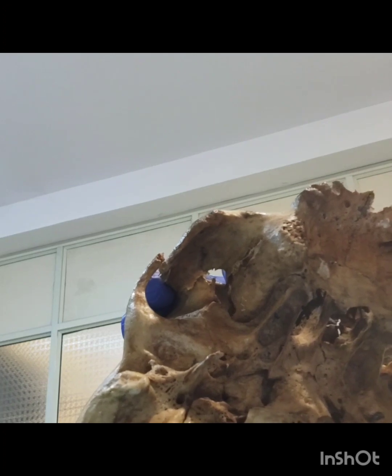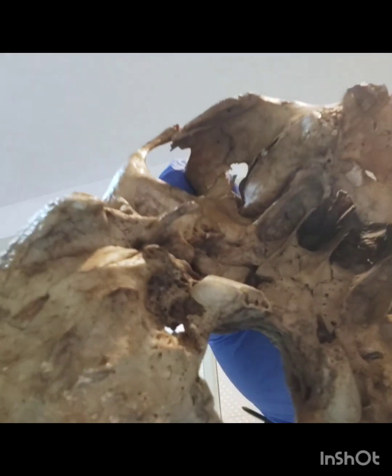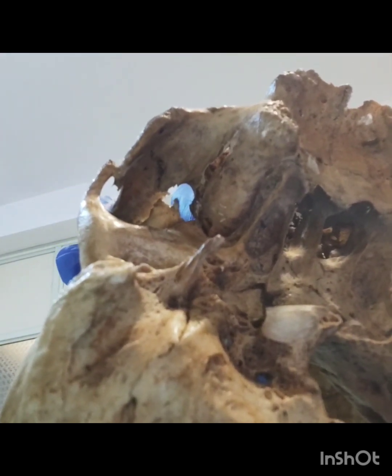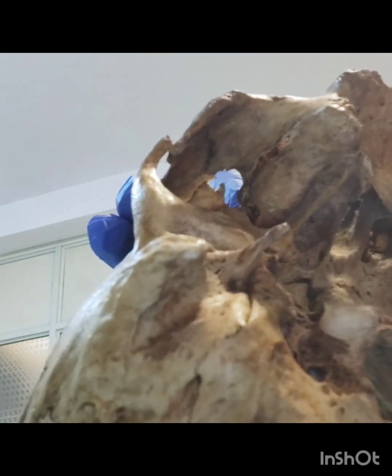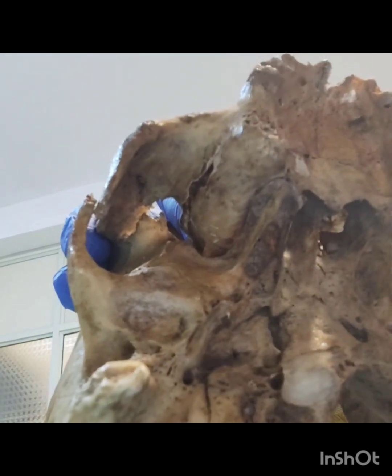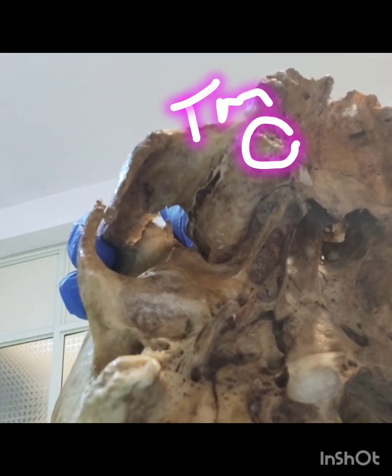So beyond the tuberosity, medial towards the mid-palatal line, can you see here? I'll show you in close. This is the lateral pterygoid plate and this is the medial pterygoid plate. Have a look. Lateral pterygoid, medial pterygoid. This is the tuberosity of the maxilla.